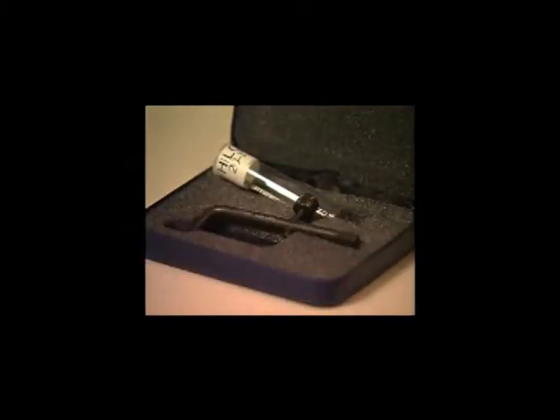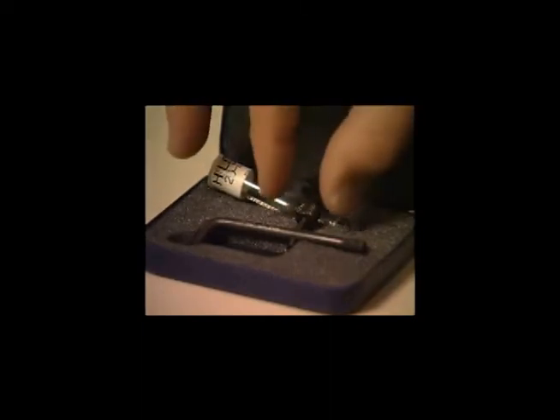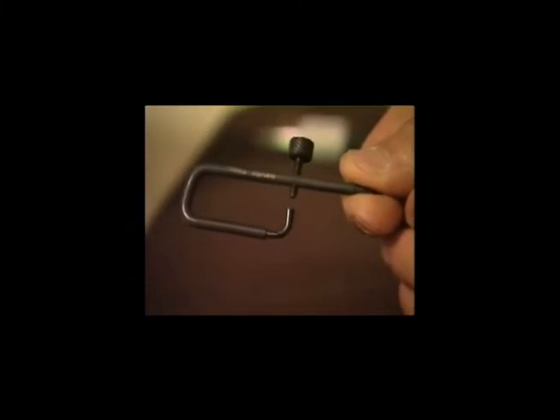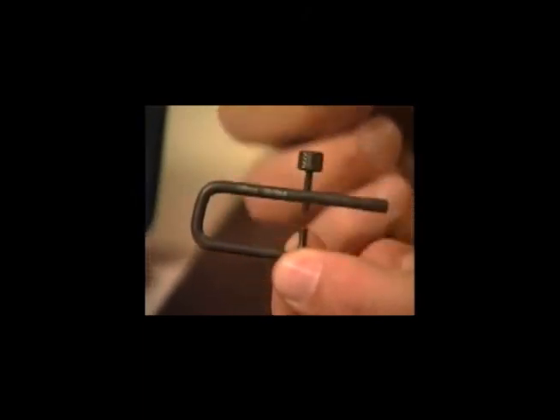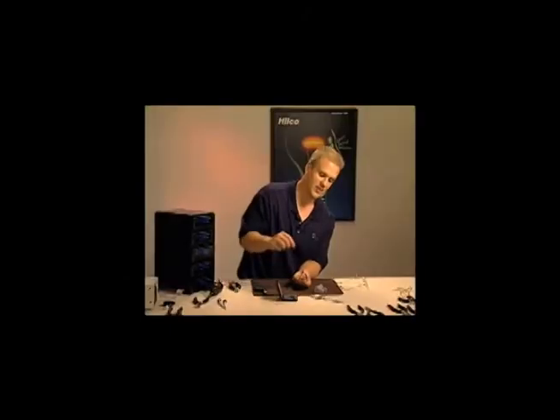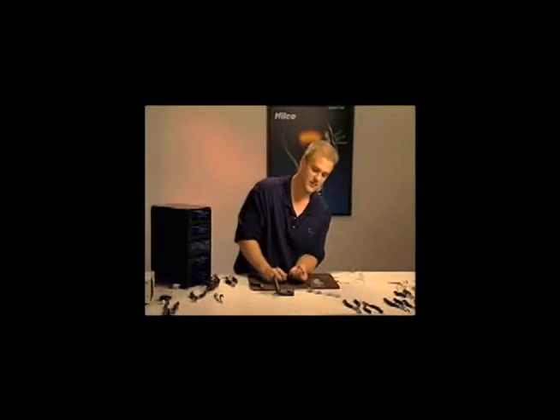So the device I'd like to show you today is called the Bullseye Screw Drilling Guide, and it is made out of tool steel. This device is used to clamp down over a broken or frozen screw, whether it's in the hinge or the eye wire. The shaft here that turns is how it clamps down onto the frame. But there's a hole that runs the entire length through that shaft, and that's actually the drill guide. The drill will pass through that, hit the screw, drill out the portion that you need, and the rest of the screw will fall out.